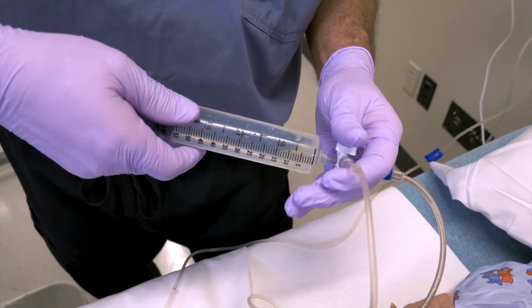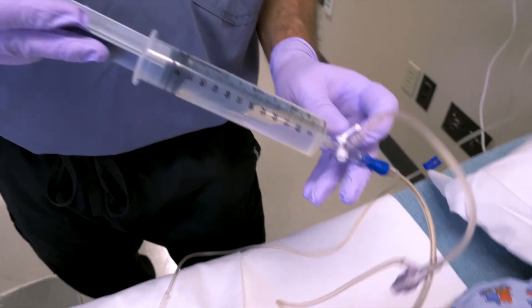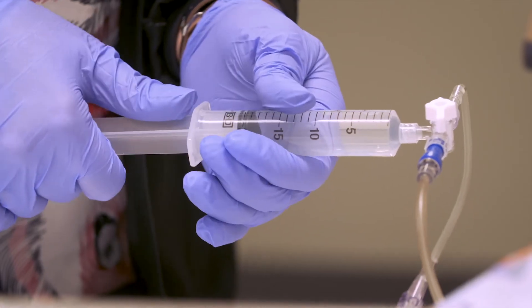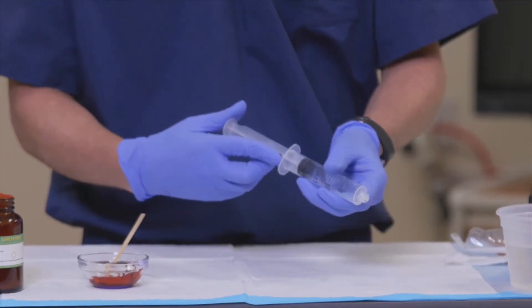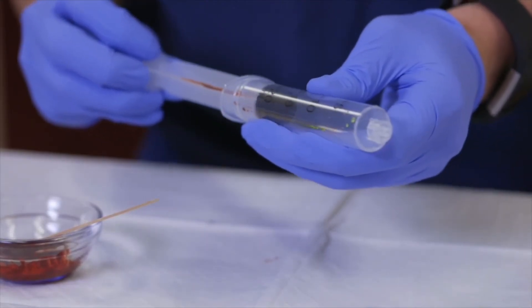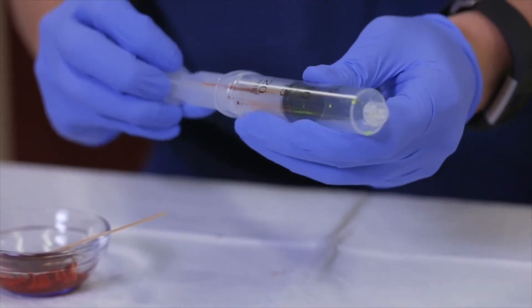Disposable syringes are intended for single use only, and once the sterile portion of the plunger is touched, bacteria may easily be transferred from the user's hand into the syringe. With additional strokes of the syringe, bacteria can contaminate the patient's IV tubing.